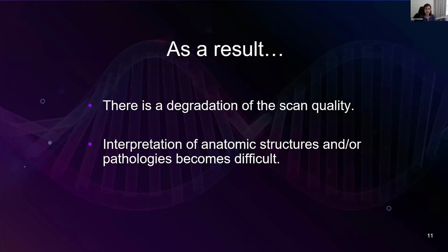Mm-hmm. I think it's also a good idea to ask the patient to swallow right before the acquisition, because when they swallow, it can also affect the airways and how you can visualize the patency of the airways. I agree 100% on that, Dr. Brown. Yeah, very good point. It's a natural phenomenon. They're going to want to do something during the process, so it's better to inform them prior to it.